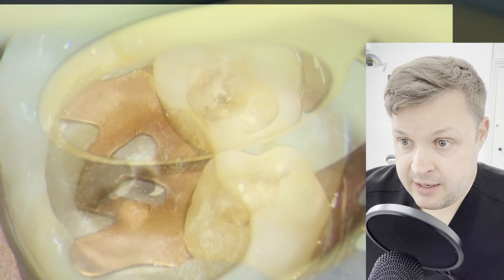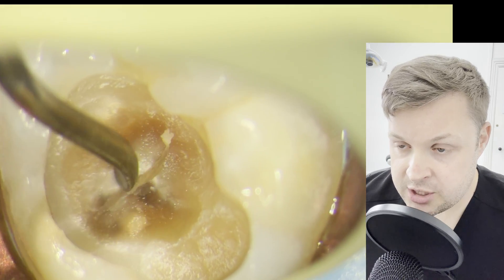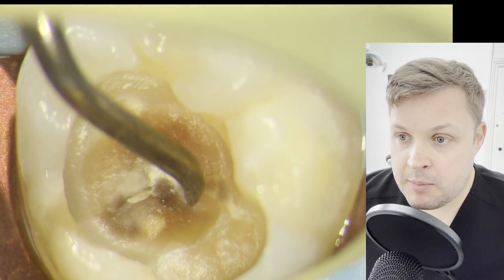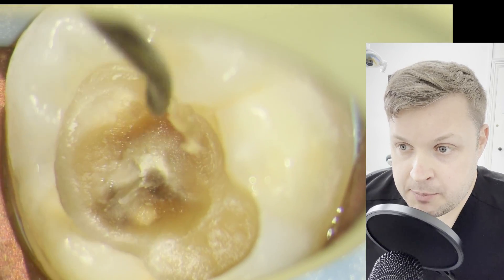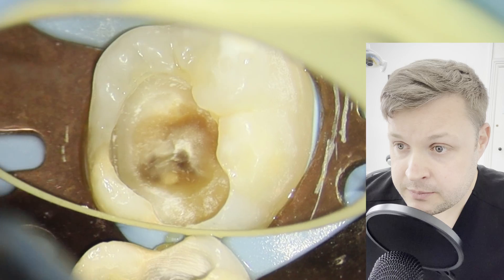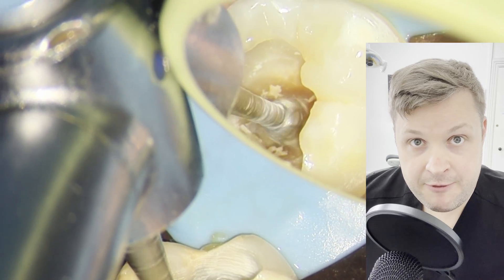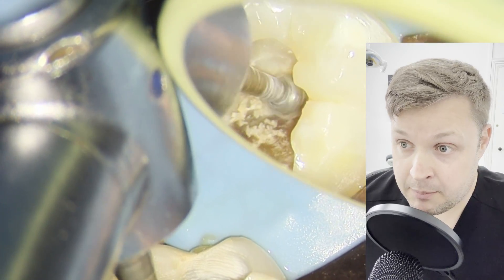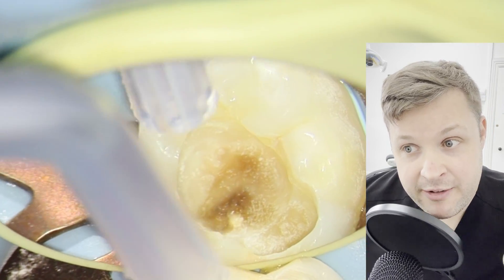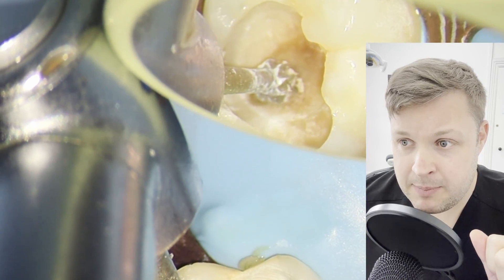Once I've removed all the decay on the outer part of the cavity, I'm drawing my attention to the base. I'm very gently assessing the decay there — I'm really concerned about exposing the pulp. I know the pulp is still alive because we did a pulp test at the last appointment. I decide some of this decay needs to be removed, so I very gently brush the base of the cavity with the slow handpiece.